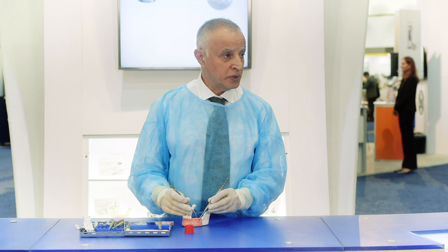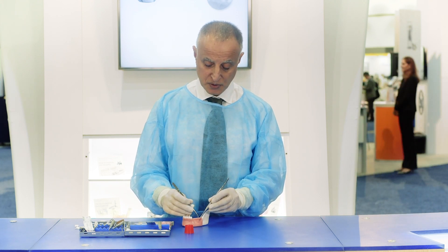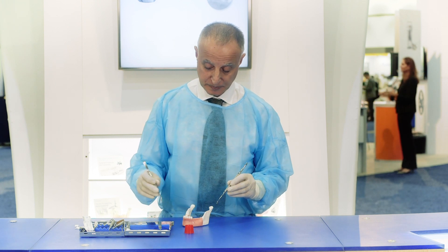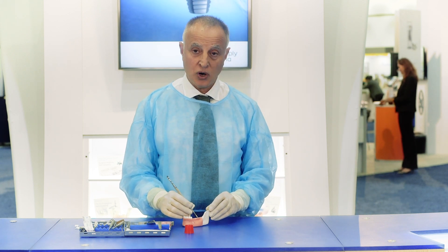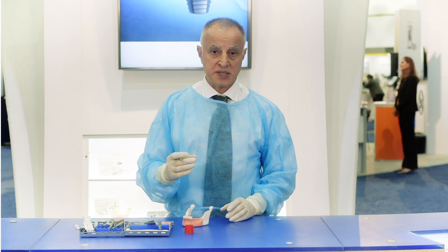The O6 Plus will adhere to the bone and conforms to the size and shape of the bone graft. Once it's in place, we take a wet gauze and hold the O6 Plus in place for 10 seconds.